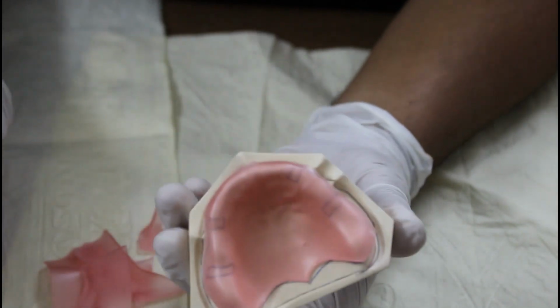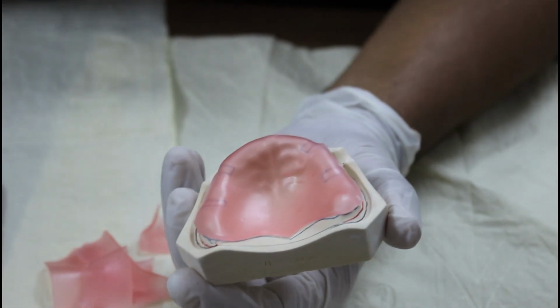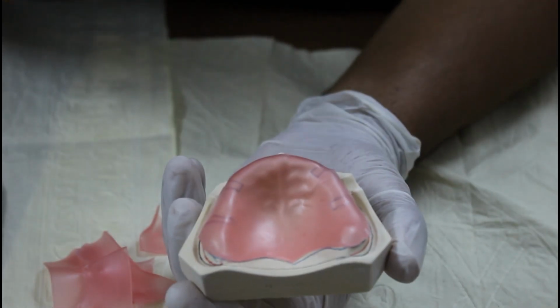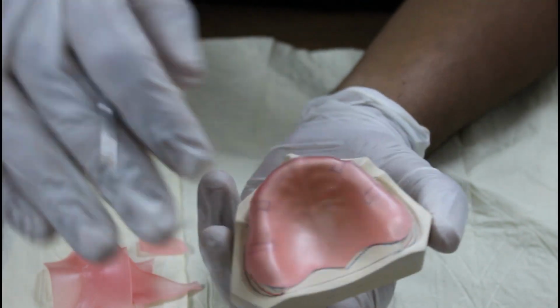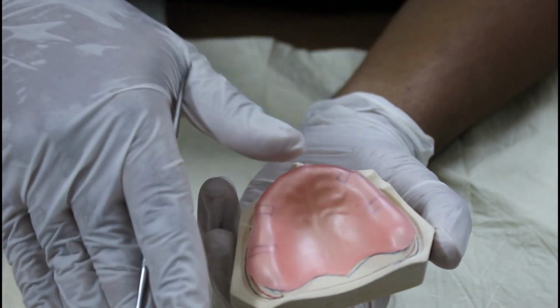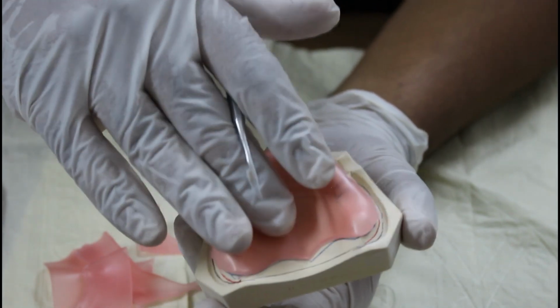It is 1.5 millimeter thick. There are different designs for spacer. You can see it on the internet. It is available in your manual also. For undergraduate level, we teach you full spacer. That means we have put the full spacer on the whole maxillary arch.